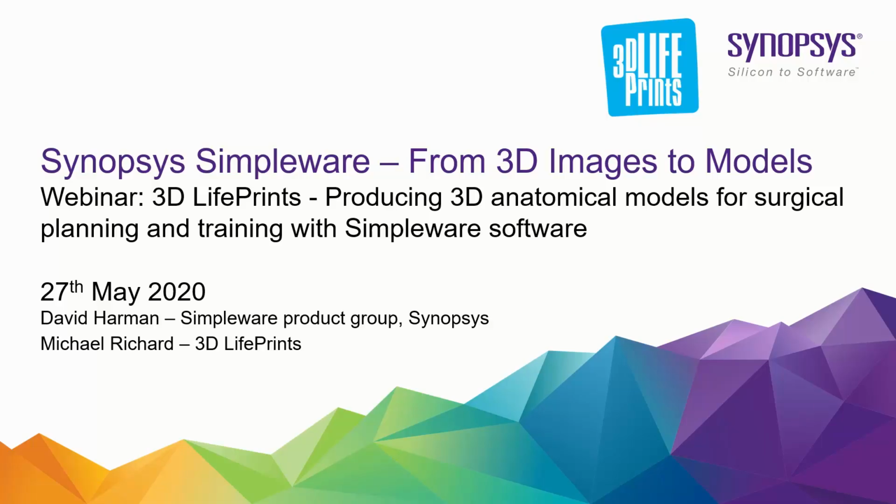Today is really focusing on 3D LifePrints and how they use our software, the Simpleware software, within their workflows for producing 3D anatomical models for a variety of different applications, and these include surgical planning as an aid for that process, and also training for medical professionals if they're planning a procedure, or even in an educational setting where they're learning how to do a procedure for the first time, and there are limitations on training with real examples of anatomy, for instance.